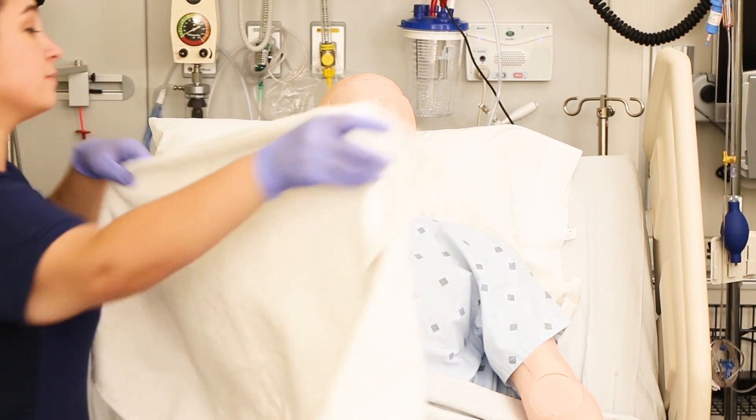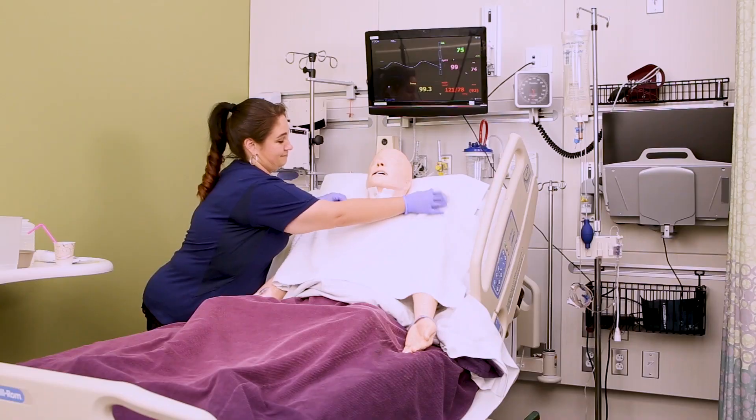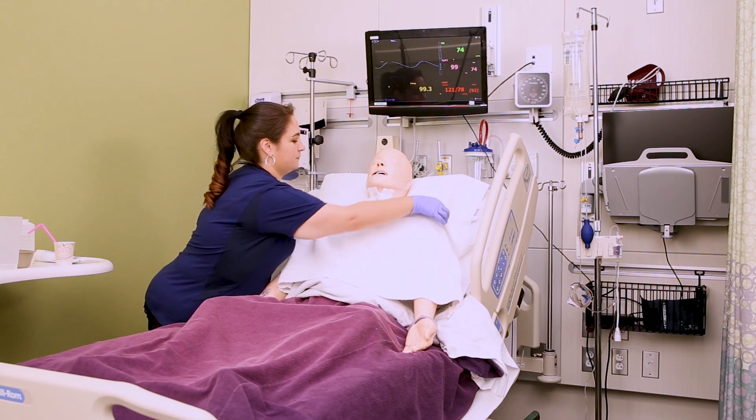Then you're going to want to lay a towel across the patient's chest. I am telling you, I have had patients throw up on me — this step is worth it.